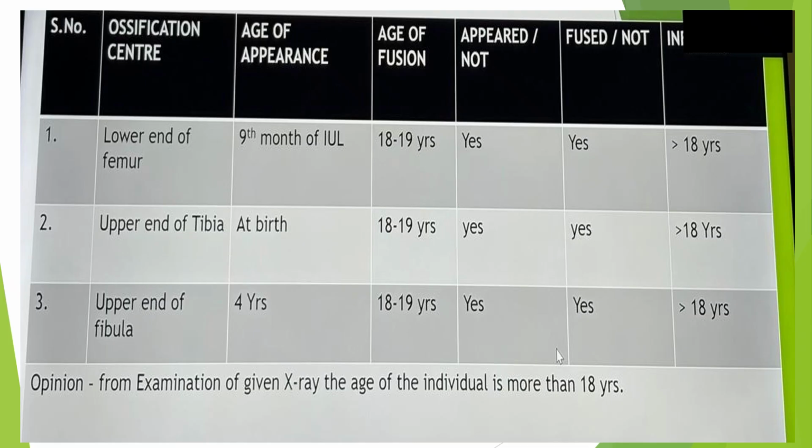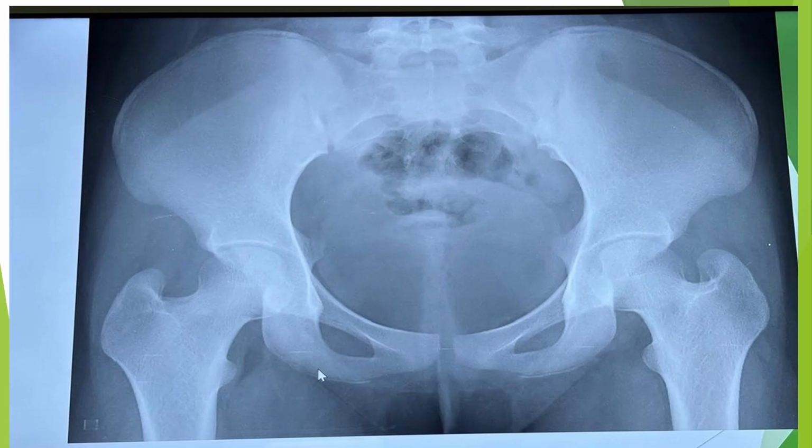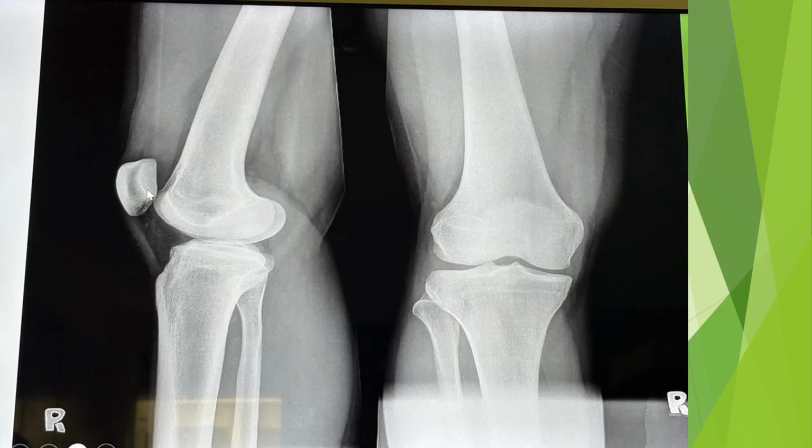So how will you opine in such cases? You will opine that from examination of the given X-ray, the age of the individual is more than 18 years. Okay. So we'll discuss this in a while. We'll move on to the next slide here.